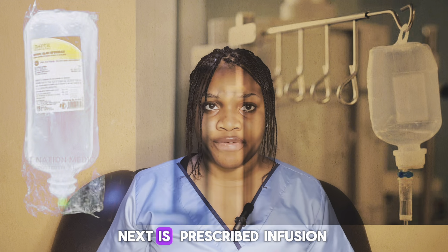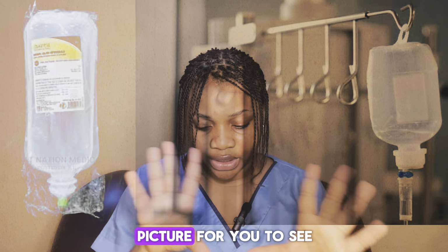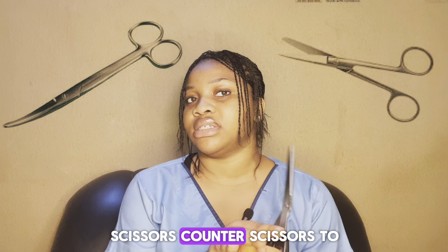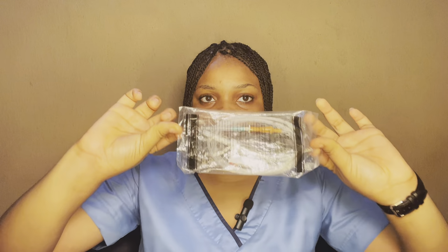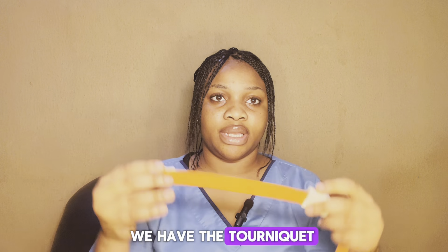Next, the prescribed infusion. I don't have any prescribed infusion here, so I'll put a picture for you to see. Then we have the scissors, to cut the tape. Of course, this is in provision. We have a giving set. We have this giving set to administer prescribed infusion.